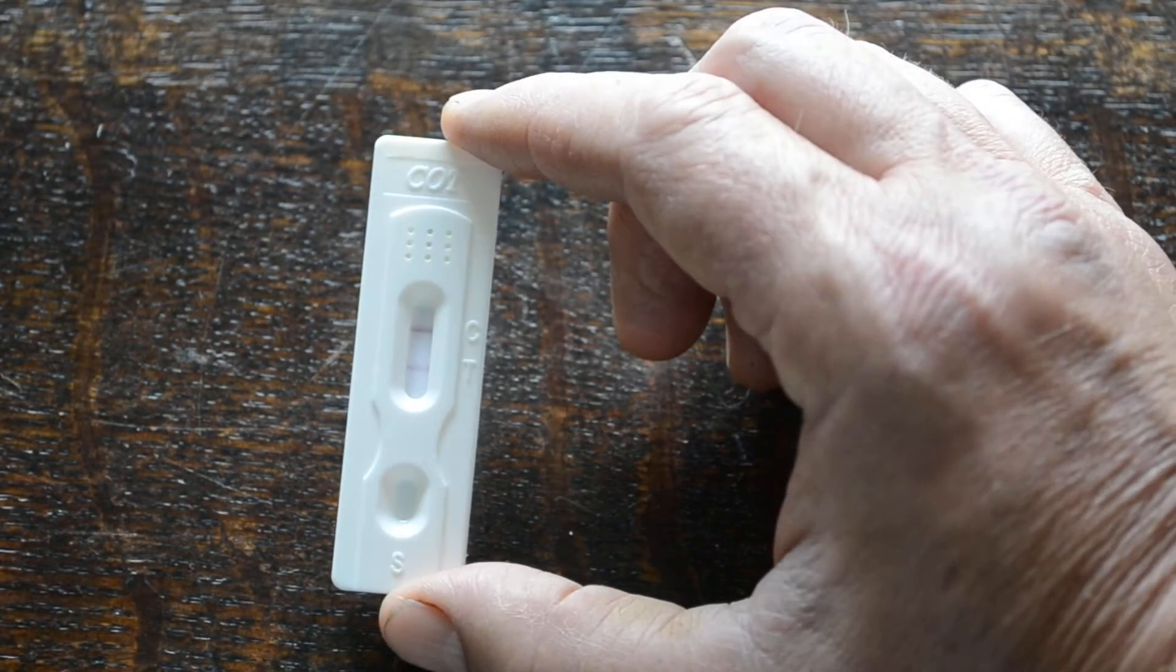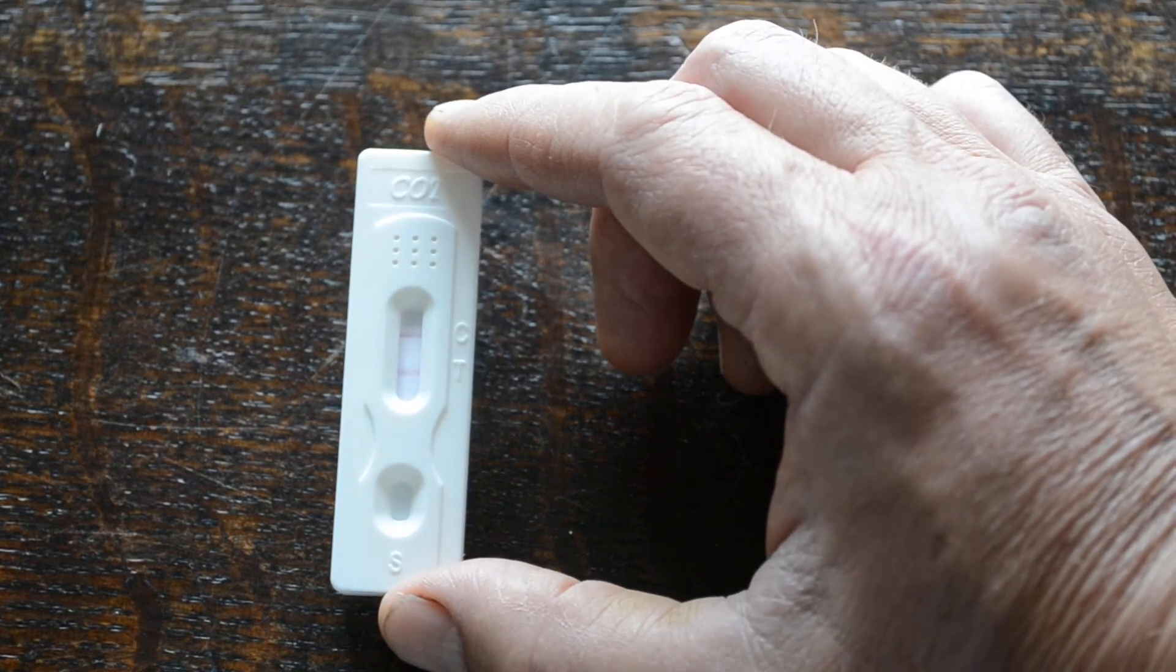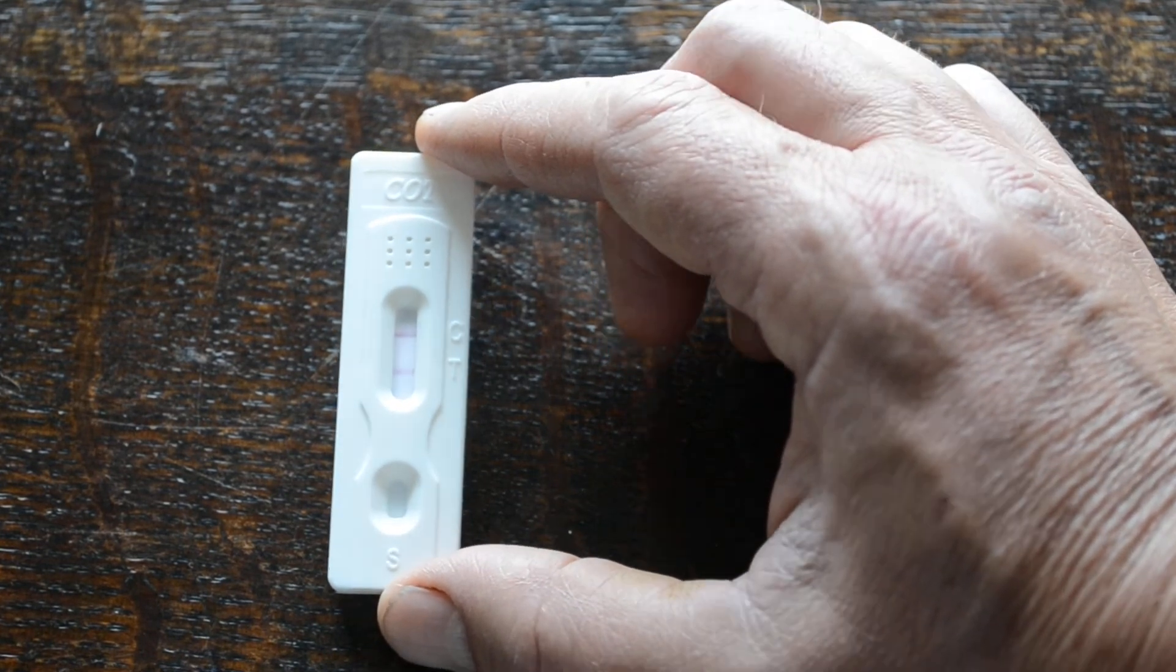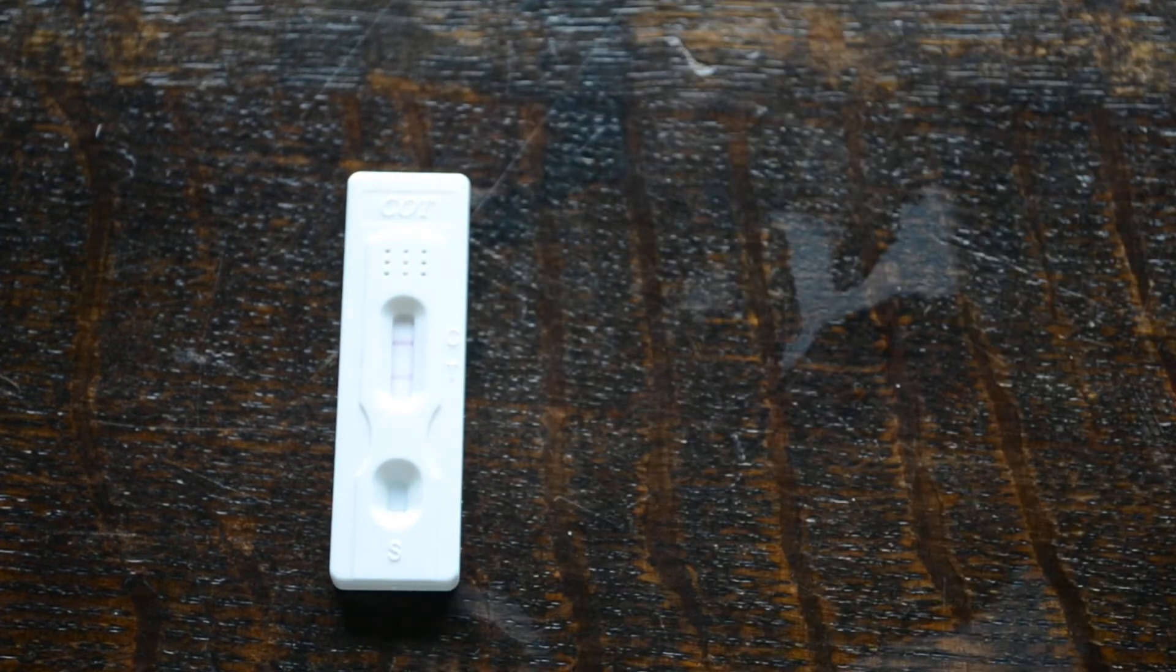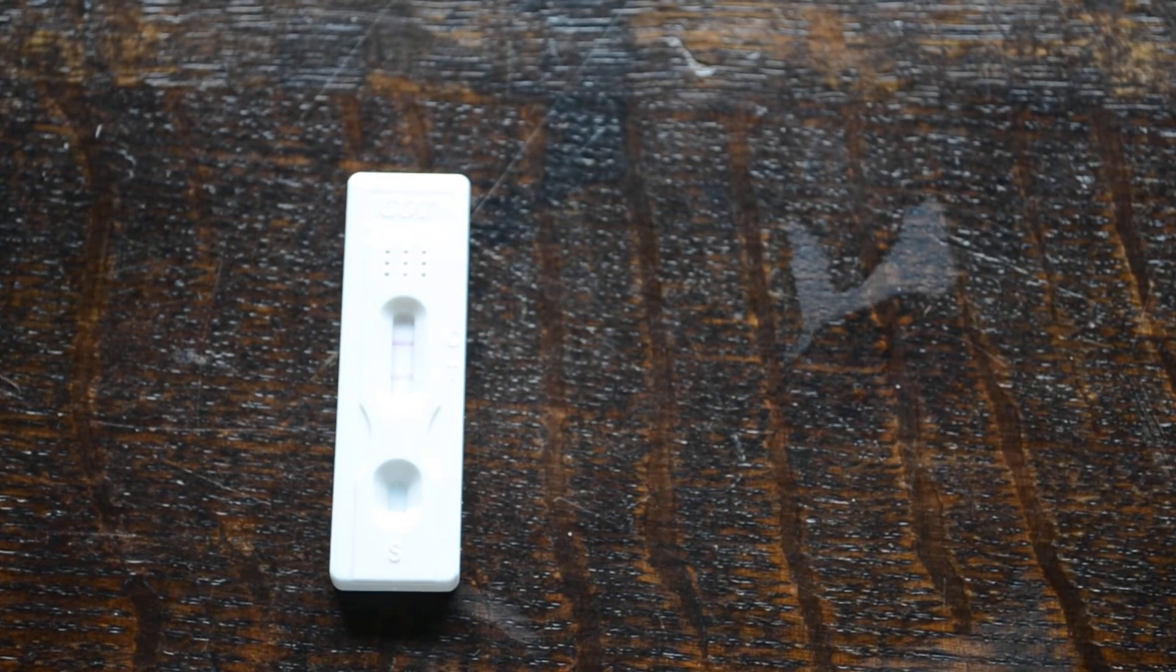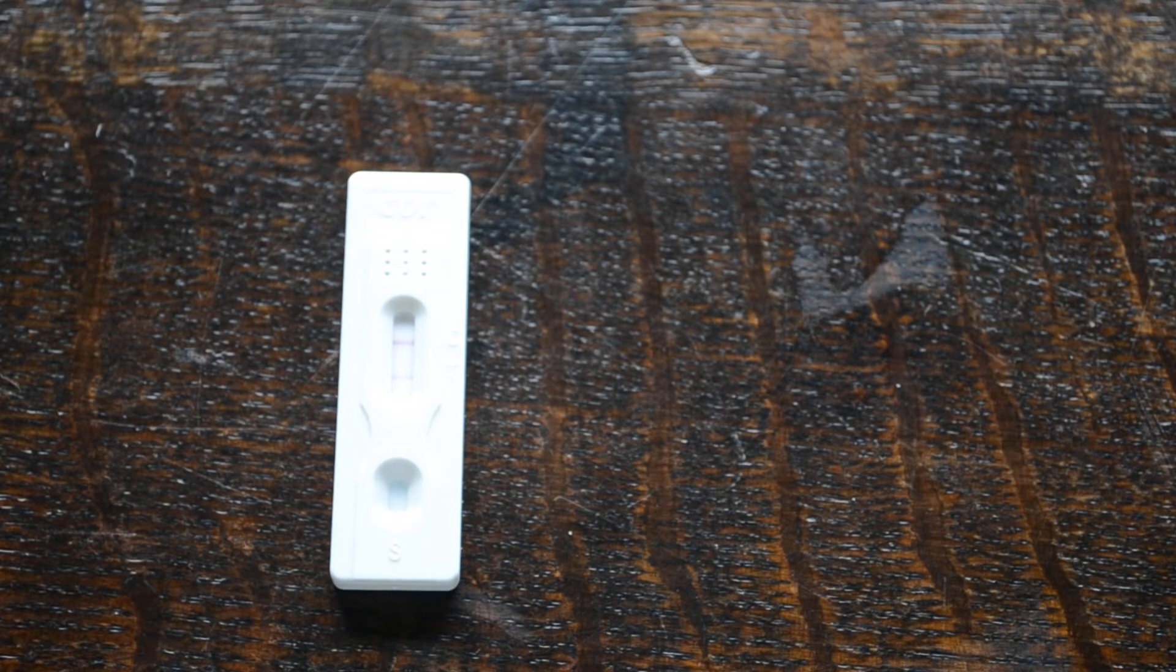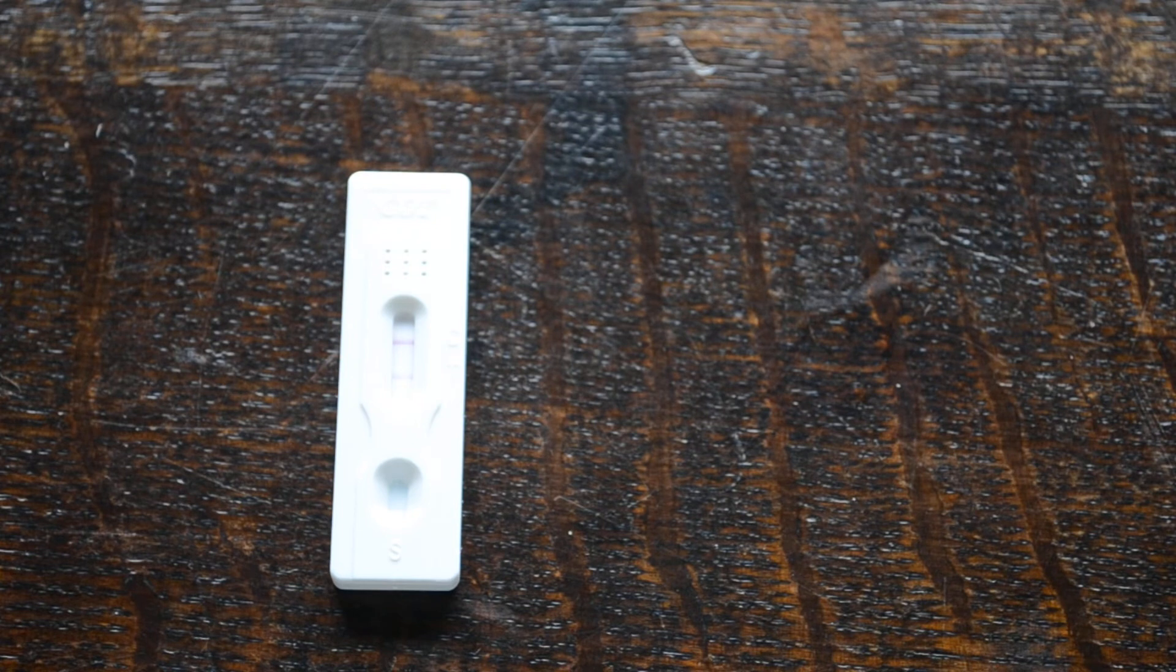But with this test result, you can see a clear negative result with both the control line and test line showing in as little as 30 seconds. There's no need to wait for the full development time when you've got clear two lines showing. That's a clear negative result. So we've performed the test for smoking on that sample and it's negative.